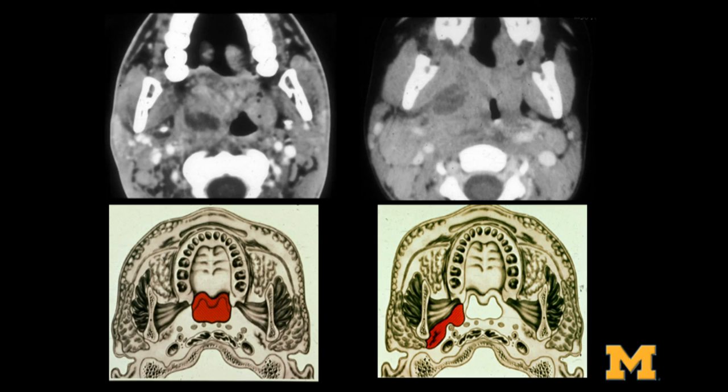And you can ask me, well, how are you so confident? I'm just a dumb radiologist. How do you know about this? And the reason I know is that the patient on your right, many years ago, at my old institution, was actually called a tonsil abscess. So they tried to drain this several times intraorally. They didn't get any pus, but they were pretty sure there was an abscess. The next day, we said it was in the parapharyngeal space. That patient immediately went to the operating room. So yes, even though there's only about 5 or 6 millimeters from here to here, note how that little nuance makes a big difference in how that patient was initially treated.